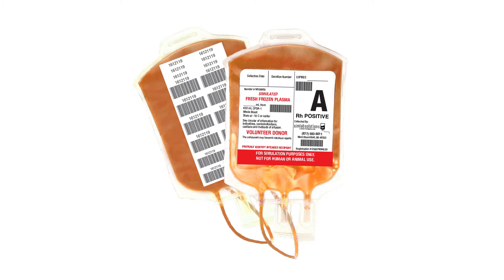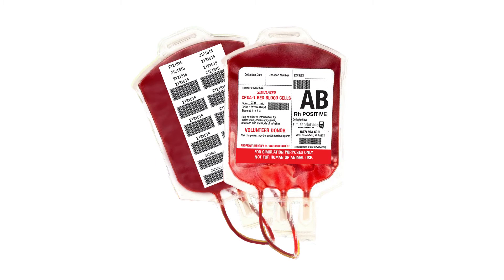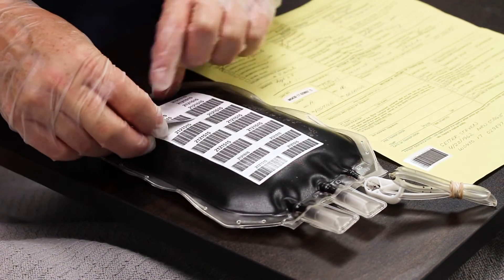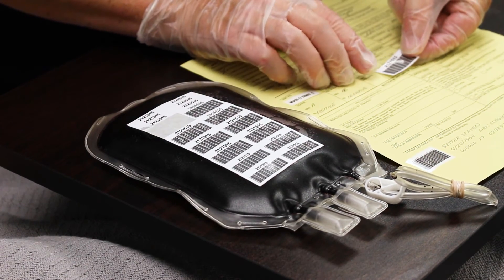SimRx also offers a full range of simulated blood products including plasma, platelets, and packed red blood cells in all eight blood types and variety packs. They're packaged in real blood bags with correctly formatted labels and barcoded patient ID stickers.